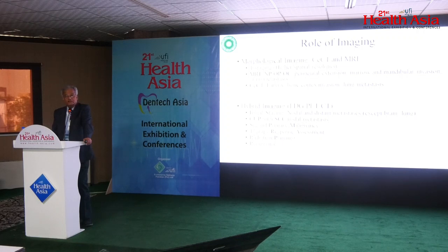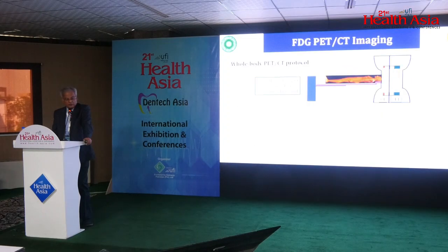It is considered as the modality of choice, as Dr. Farooqi has mentioned, in carcinoma of unknown primary for the detection of the primary tumor. Second primary tumor during the workup of head and neck cancer is not uncommon, and it is seen in a sizable portion of the patients. Then finally, the radiation planning and the recurrence.